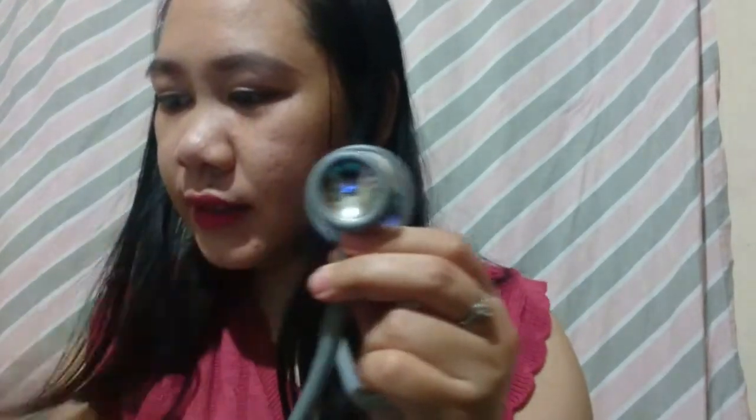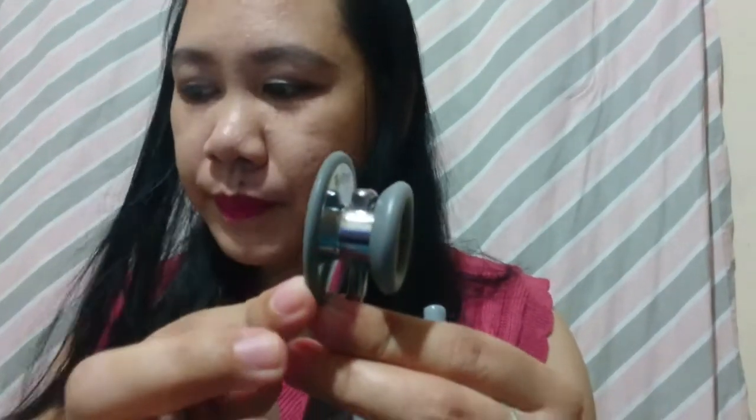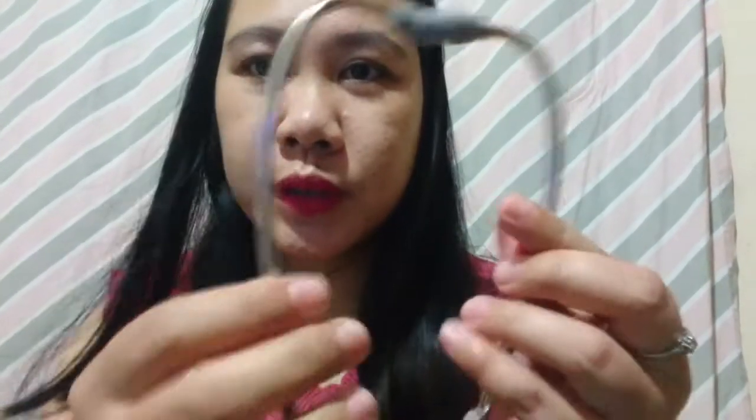This is the bell, and this is the chest piece rim. This is the ear tube, and this is the soft ear tips. This is the tubing.